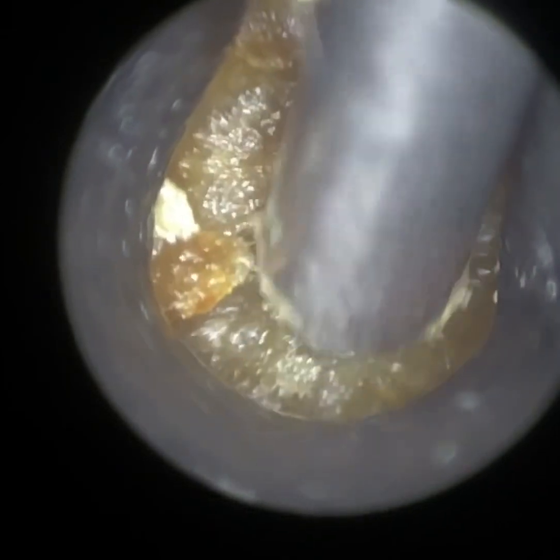Again, just using our 4.25mm speculae. The consistency of this wax and keratin is a bit softer and mushier, a bit like mashed potatoes. So it's a bit harder to get a suction grip because instead of suctioning, the sucker is actually indenting itself. You can see some of the indents the sucker's making into the surface of this keratin wax.